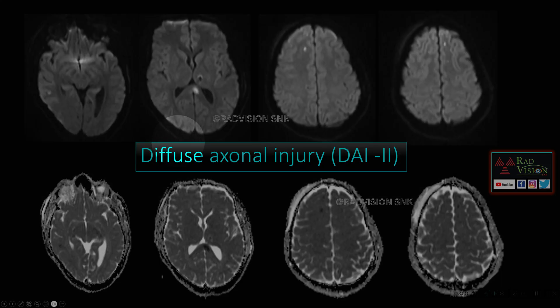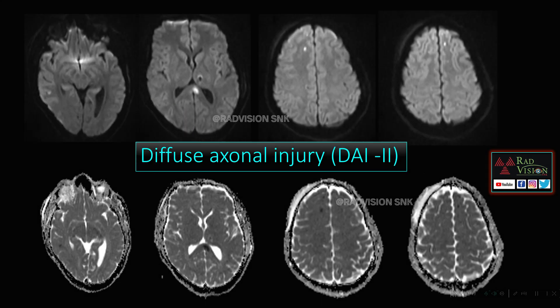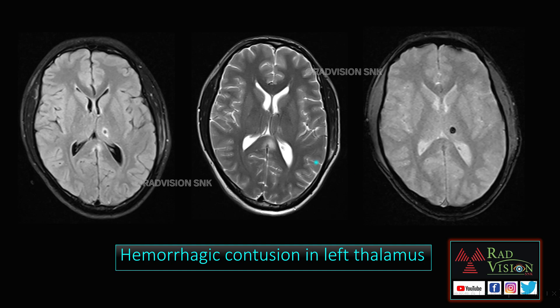In this case, there are hyperintensities on DWI noted in the splenium of corpus callosum, pericallosal area, gray-white matter junction of the right temporal lobe, and bilateral frontal lobes, with low ADC values. This is a classical case of diffuse axonal injury (DAI) Grade 2, because it involves both the corpus callosum and the lobes. There was also a hypointense lesion in the left thalamus showing blooming on GRE with perilesional edema — this was a hemorrhagic contusion in the left thalamus.